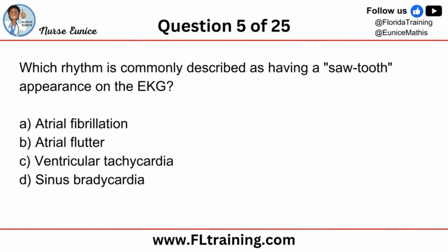Question number 5. Which rhythm is commonly described as having a sawtooth appearance on the EKG? Is it atrial fibrillation, atrial flutter, ventricular tachycardia, or sinus bradycardia? Good morning, Monique. A sawtooth appearance on an EKG.